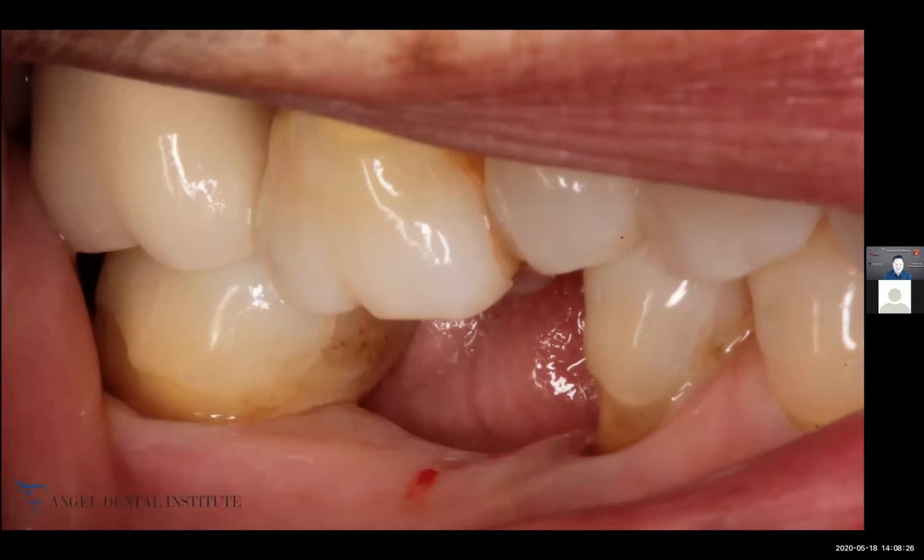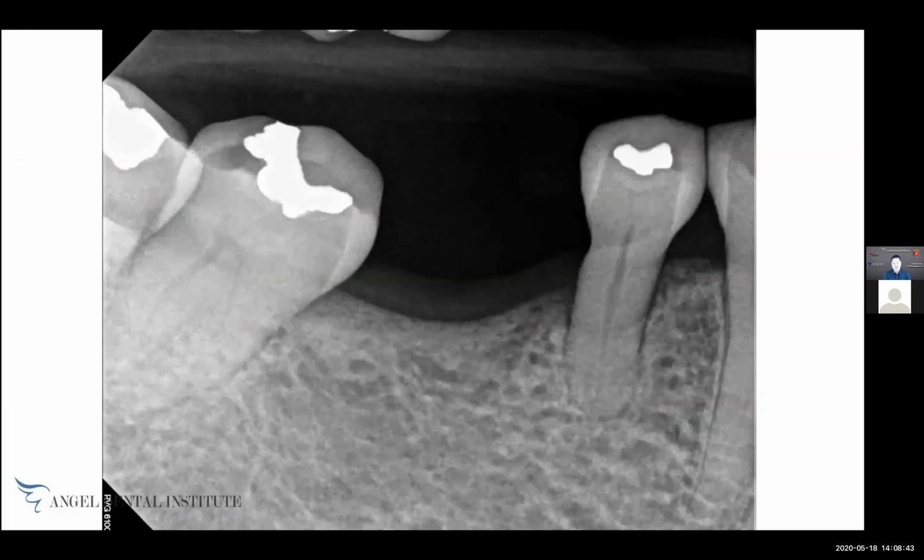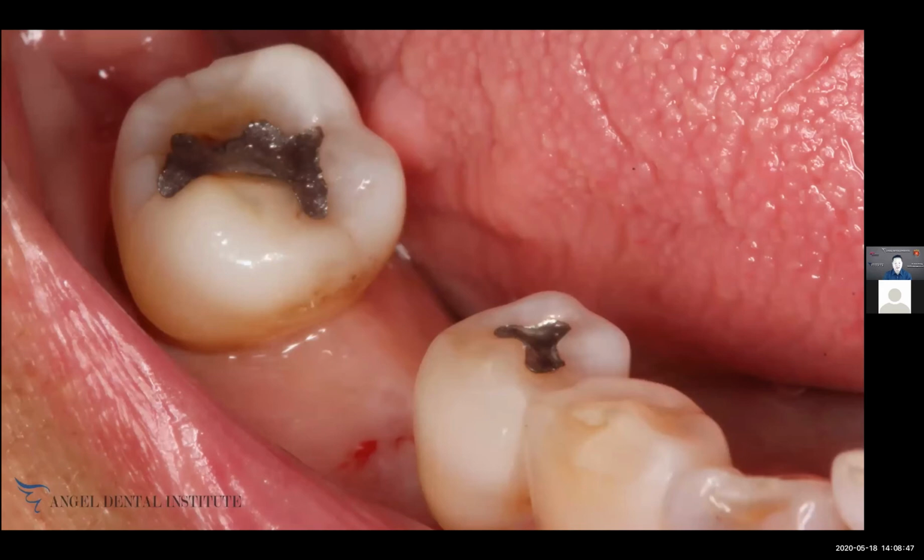I'm going to show you a typical case. First molar is missing. It's also because it's the first permanent molar tooth coming in the posterior, and we don't take care of our teeth, so it's obviously the first tooth missing. This patient comes in, and this is a pre-radiograph, pretty straightforward. I look in, patient has wide ridge, plenty of keratinized tissue, everything's looking perfect.